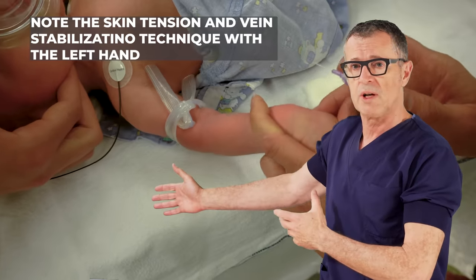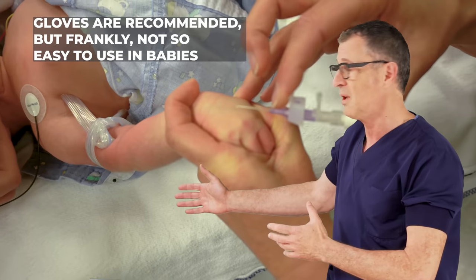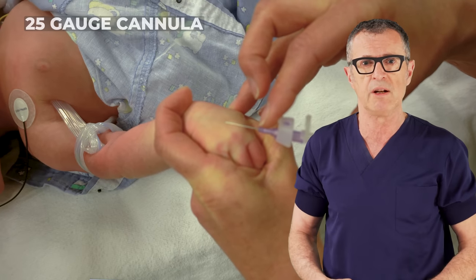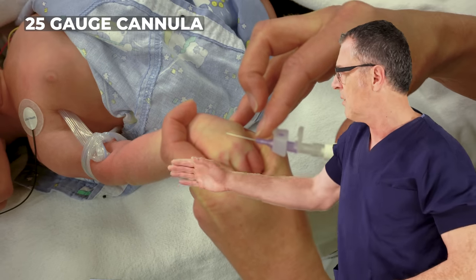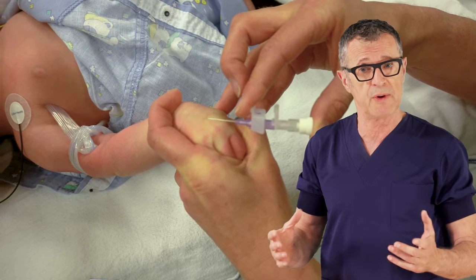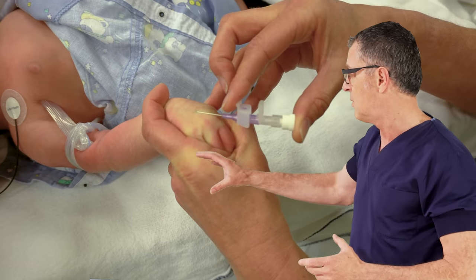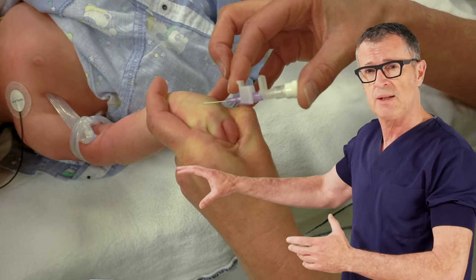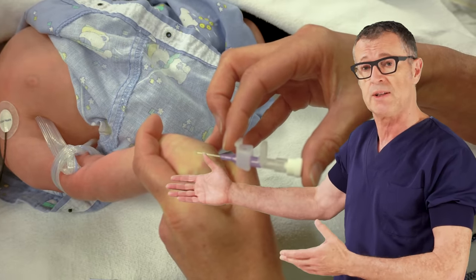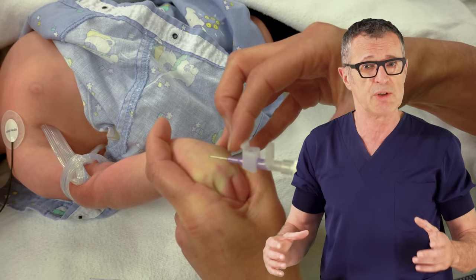Everyone advises using sterile gloves when doing this; however, this is extremely difficult when using gloves. You really want to have the absolute utmost touch in your hands when dealing with small veins. After one more skin preparation, a very small 24 or 25 gauge IV is inserted at a very low angle — but pay attention to how the hand is stabilized. You have to stabilize the hand, fix the skin, and fix the vein without obstructing the flow in the vein so you can keep the lumen.